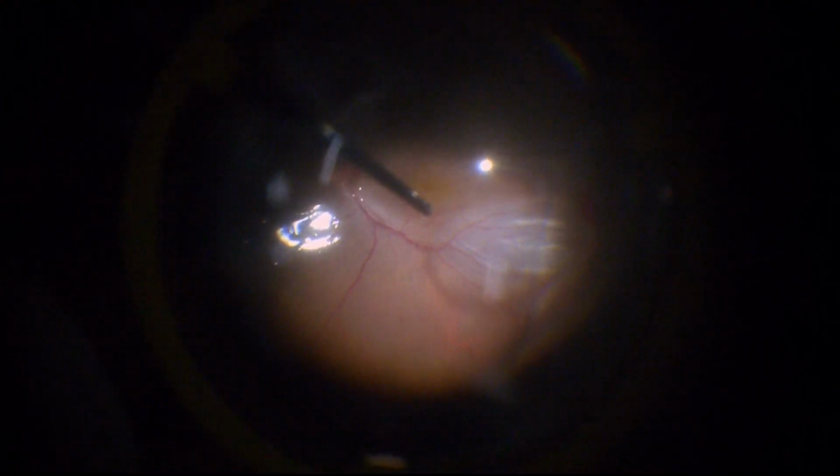And as a result, I was testing this out by teasing it, seeing how it moves. Although this was not a single body, still, because it looked round and pebble shaped, I presumed that this must be the crystalline lens. However, this was a surprise.